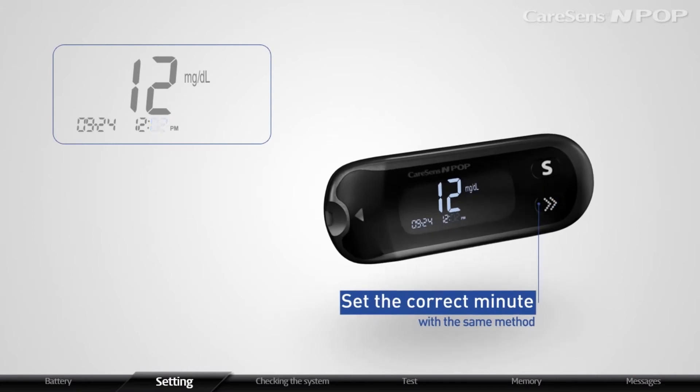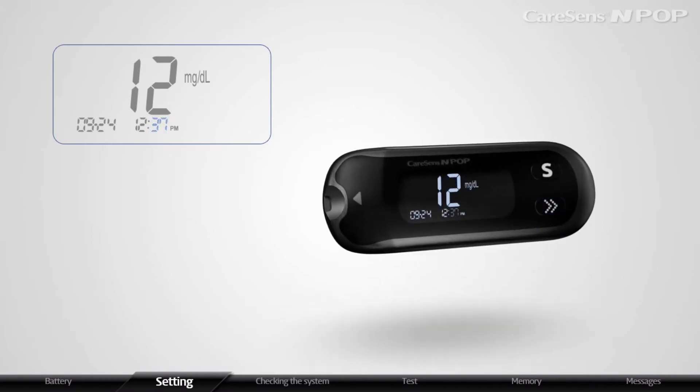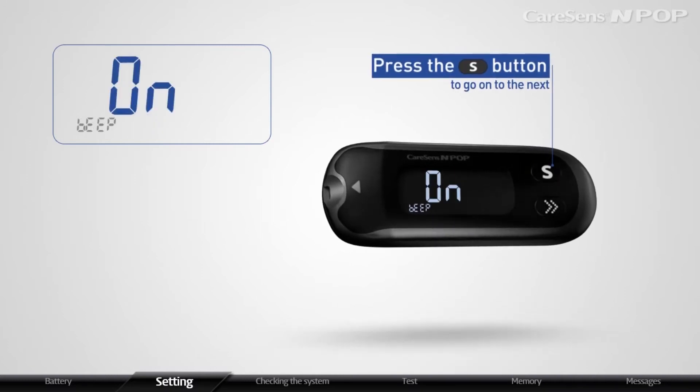When the minute blinks on the display, set the correct minute with the same method. After setting the correct time, press the S button to go on to the next.